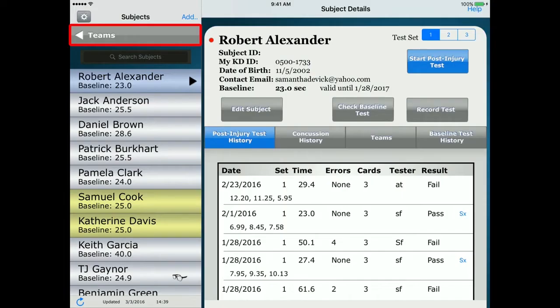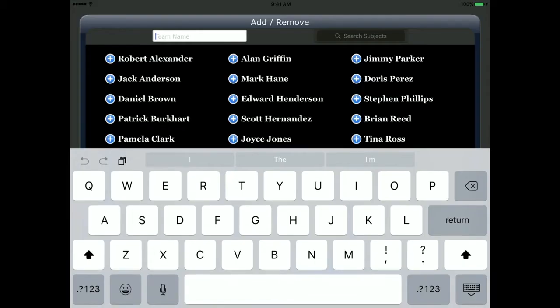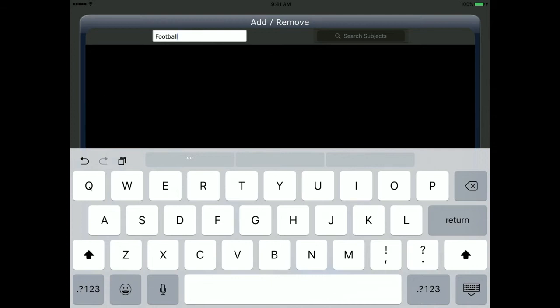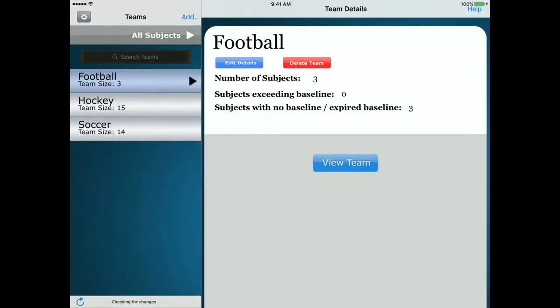Adding a team: Go back to Teams in the upper left corner to see a list of all your teams. The KD test app allows you to add teams to help organize your subjects and athletes. This function is available to KDTOS account administrators and users with access to all subjects. Tap Add to add a new team and enter the team name. Swipe right or left to find subjects or search in the search field. Add subjects by tapping the plus, or remove them by tapping the minus sign. Tap Done when complete — your new team now appears in your team list.